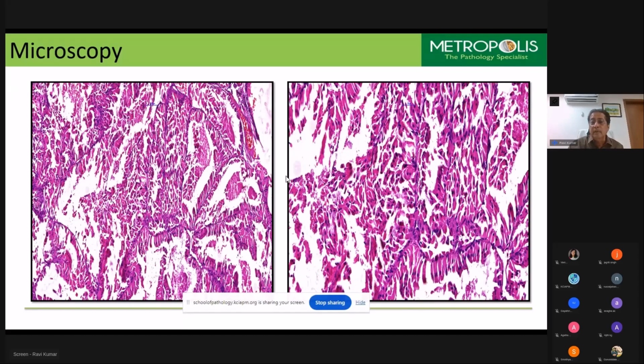But maybe we can demonstrate it to make your diagnosis of hidradenoma papilliferum. But I don't see any papillary lesions at all, first of all. And secondly, hidradenoma cells are columnar, but they will not have so much pinkish coloration, so dark pink, as you see here. That's the difference, I feel, basically. And it comes from a sweat gland origin, right?